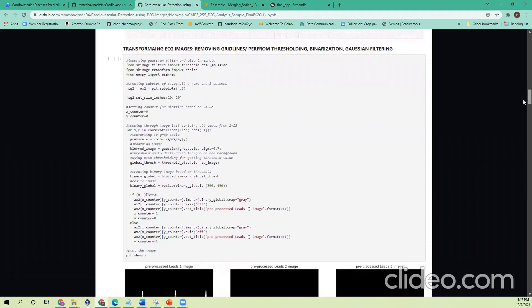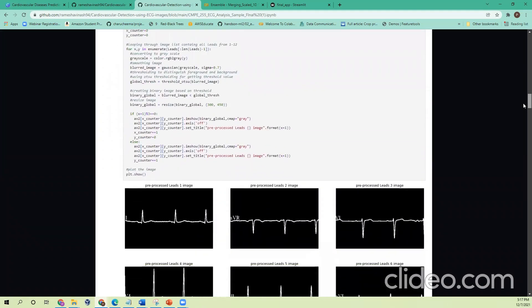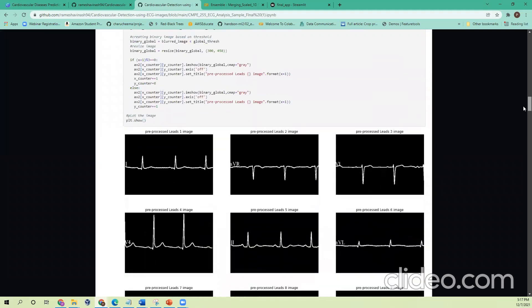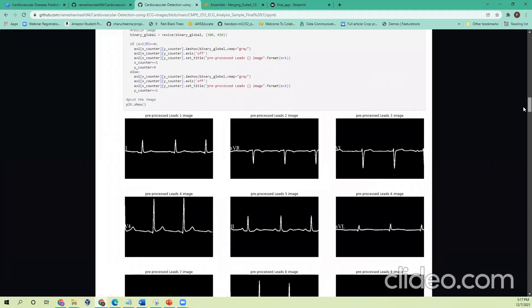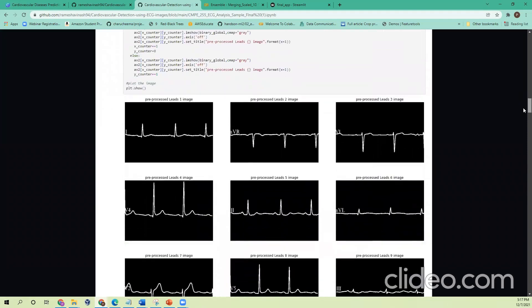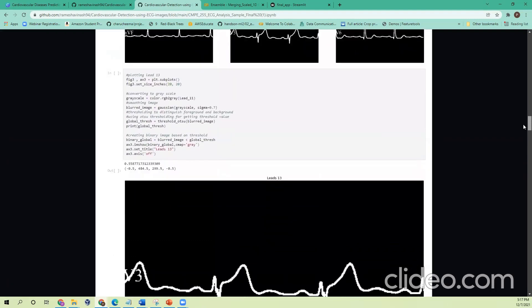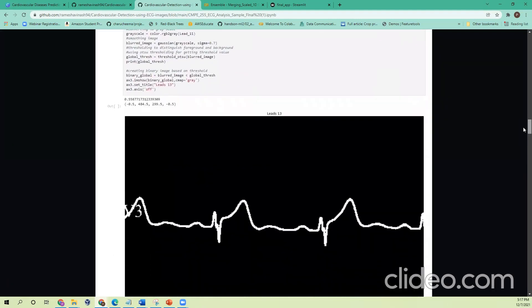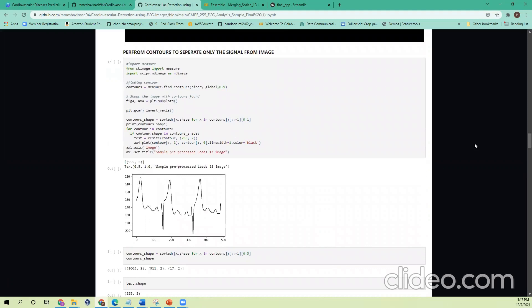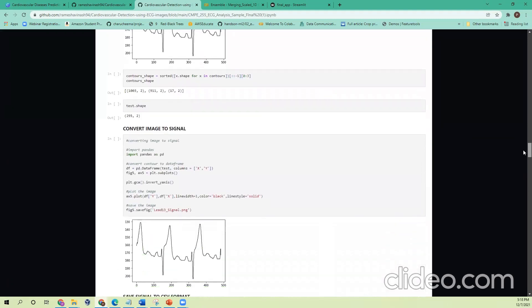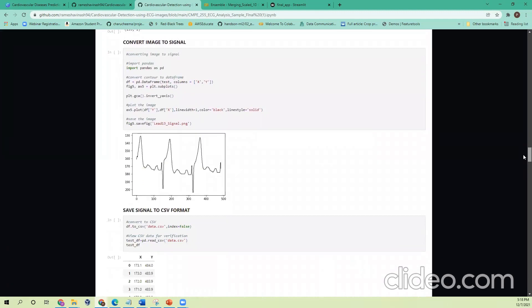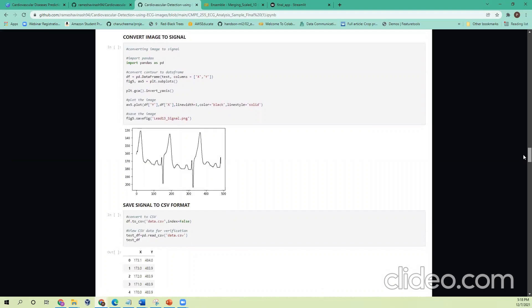We also use Gaussian filtering for smoothing the image to give the signal higher priority over the background. So we used Gaussian filtering, thresholding, and other basic image processing steps to extract only the signal from the image. We go from an RGB image to grayscale and then to a binary image. Once we have the binary image, we use contouring to extract only the signal out of it.